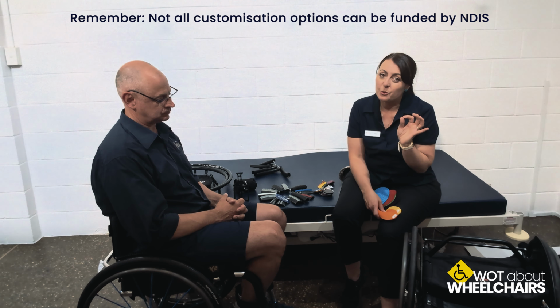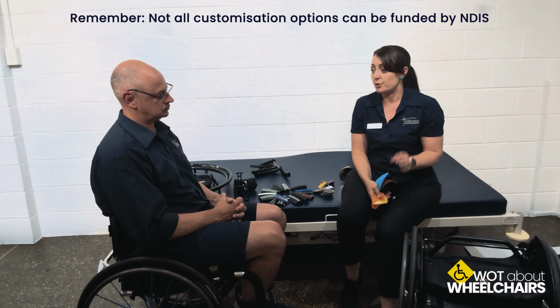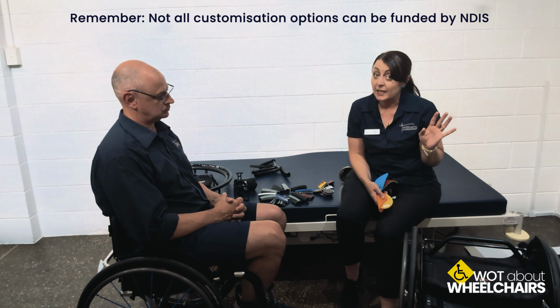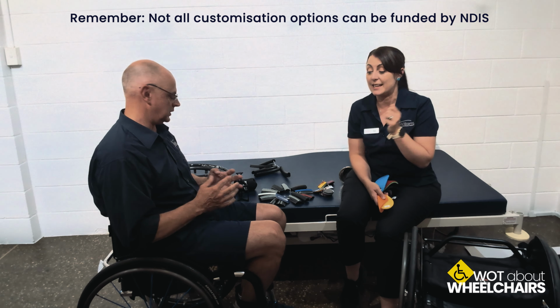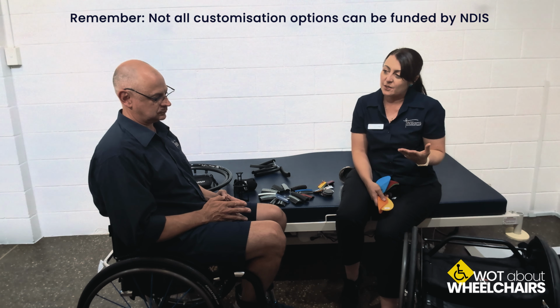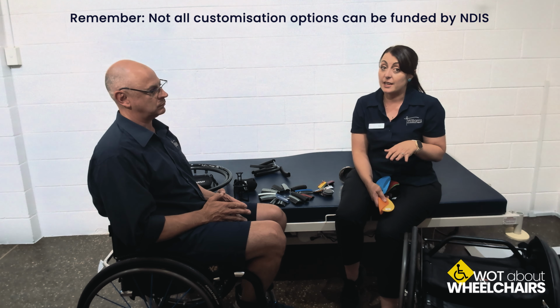A little key point, which a lot of people don't know, we can do this application for you. You are welcome to go to a baby supply place. Some of the pram attachments are awesome and easy to adapt for wheelchairs as well. So, you know, cup holders, mobile phone holders, all sorts of stuff. You just have to think a bit outside of the box, but we like to say, consider what's reasonable, consider what has to be funded through NDIS and what we can justify.